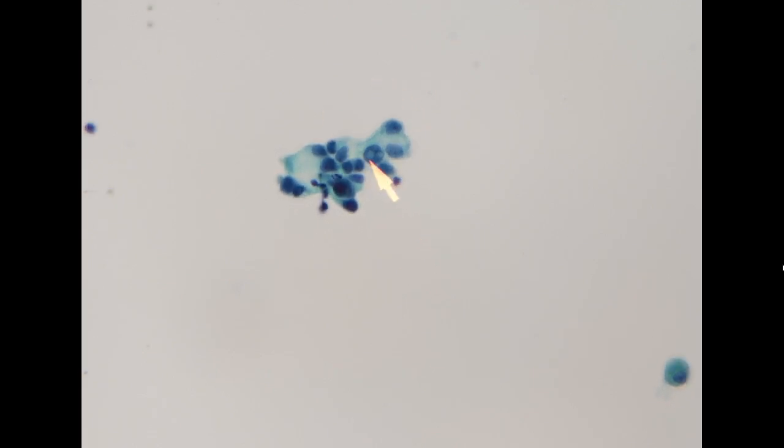But because we see the pseudo inclusion, this is consistent with metastatic tumor cells. So this is consistent with cystic change of papillary thyroid carcinoma cells. So for this lymph node, we will sign it out as positive and consistent with metastatic papillary thyroid carcinoma because we identified the typical nuclear features.